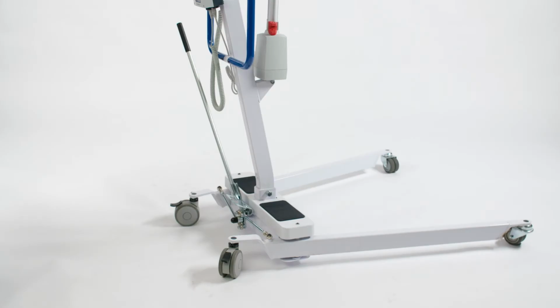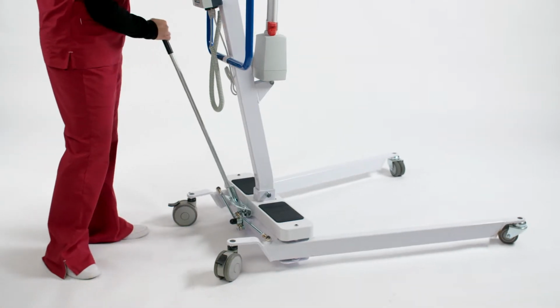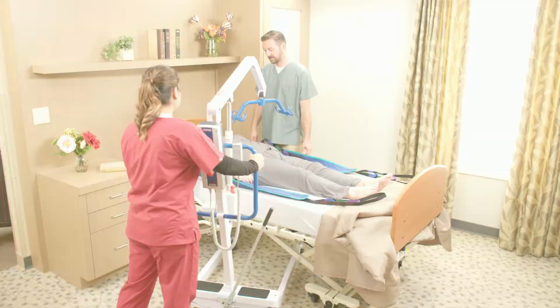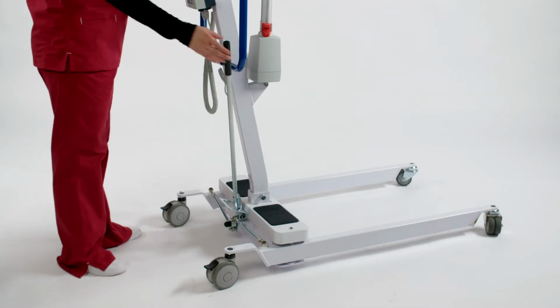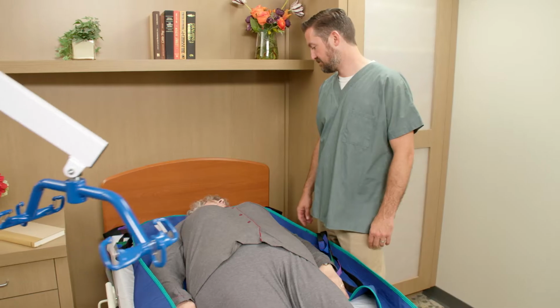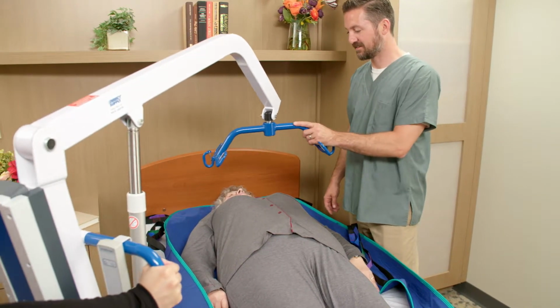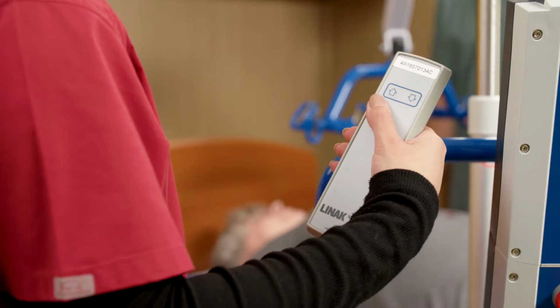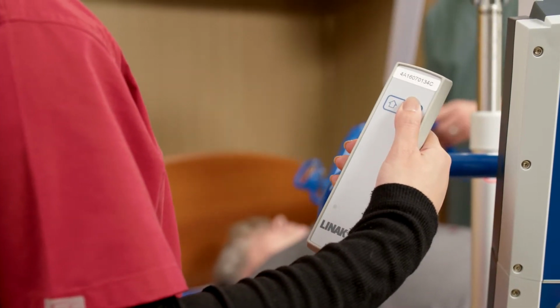When lifting a resident, the legs of the lift must be in the maximum open position for stability and safety. If it is necessary to close the legs of the lift to position the lift under the bed, return the legs of the lift to the open position and position the lift over the resident by using the steering handle. Position the lift for use with the spreader bar positioned a few inches above the resident's solar plexus. Press the boom down arrow on the hand control to lower the boom for easy attachment of the sling.